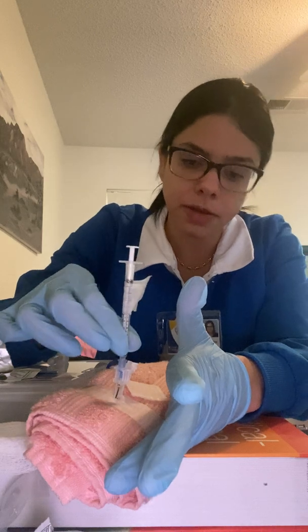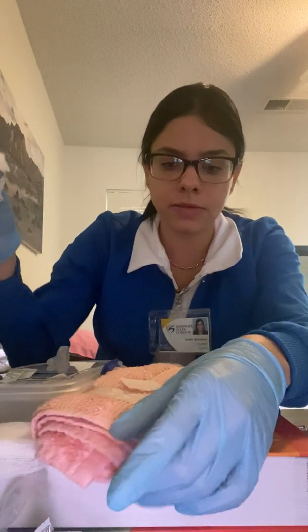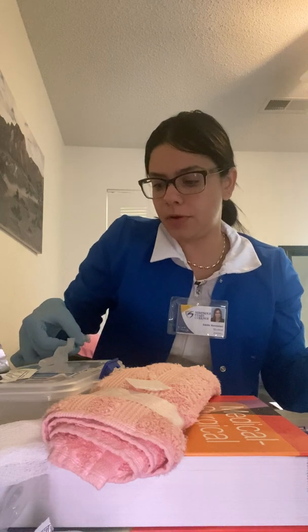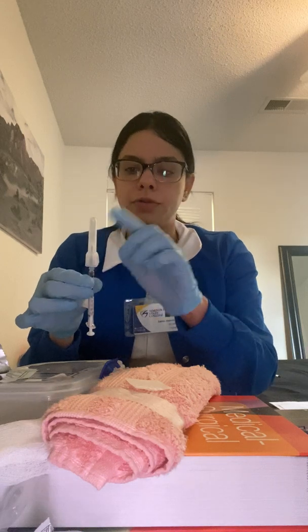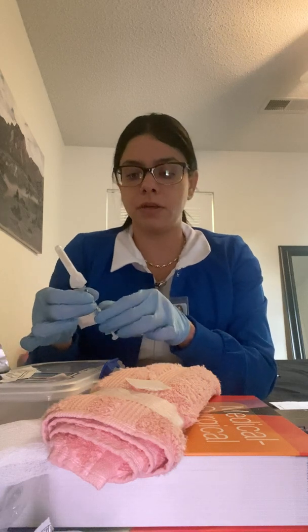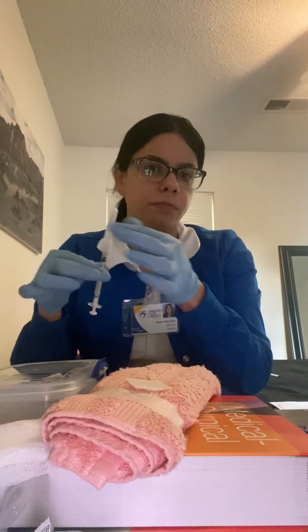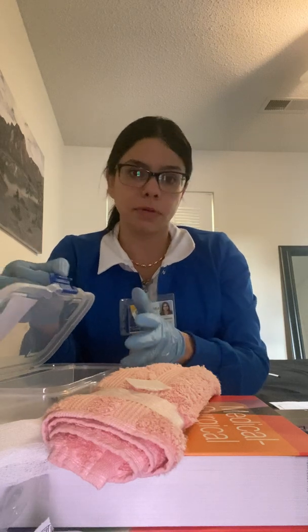Right, once I'm done, I'm going to take it out the same way I went in, as a dart. I'm going to go out, release my patient's arm. I'm going to cap it. In a real world environment, you want to use your secure lock and dispose of it. For this video, since I need to reuse my syringe, I'm just going to recap it, and that's it. And then I'm going to dispose of it in my sharps container. Every hospital, every doctor's office has one, so you just have to make sure that you put it in the proper box.